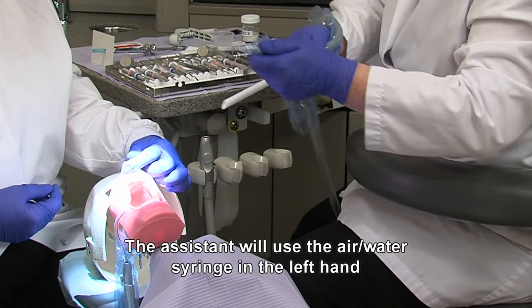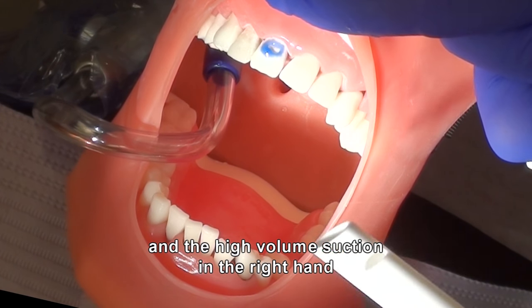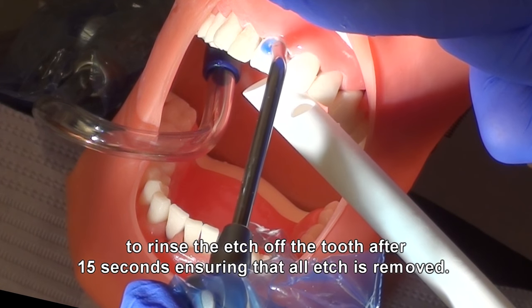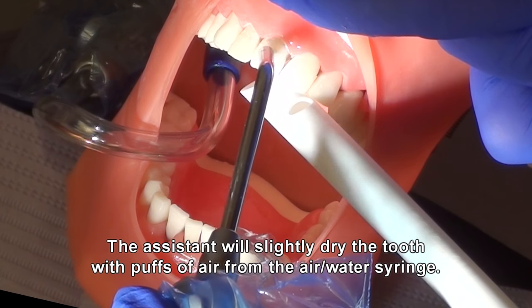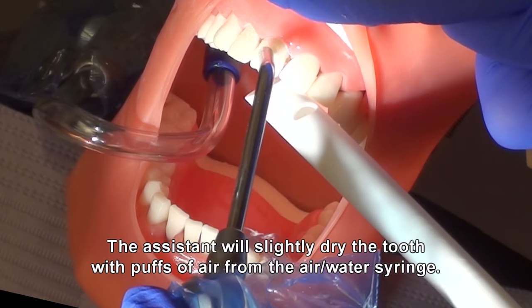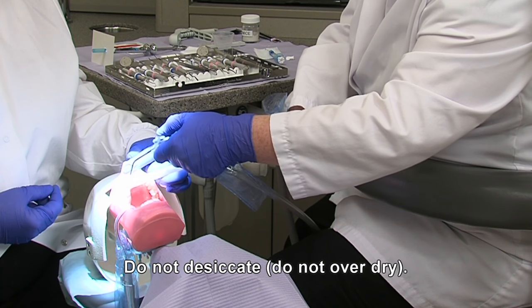The assistant will use the air-water syringe in the left hand and the high-volume suction in the right hand to rinse the etch off the tooth after 15 seconds, ensuring that the etch is removed. The assistant will slightly dry the tooth with puffs of air from the air-water syringe. Do not desiccate or overdry.